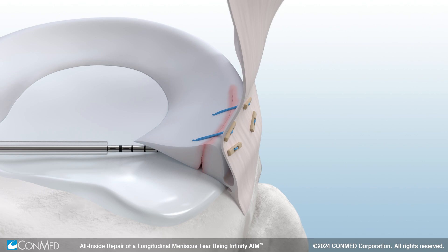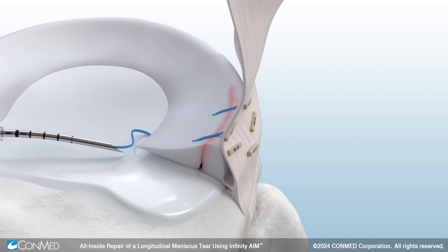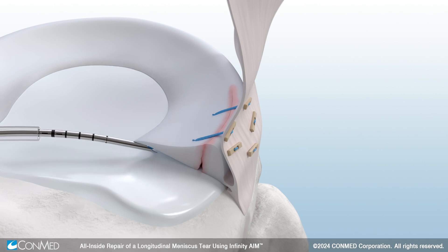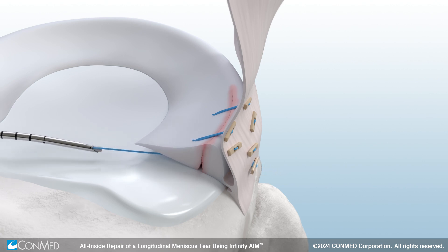Pierce through the capsule and deploy your implant. After the implant is deployed, pull the needle back out of the meniscus with enough suture slack to reach the next piercing position. Pierce the next location through the meniscus and capsule while still being on the inferior part of the meniscus. After the implant is deployed, pull the needle and use the red wheel to tension.